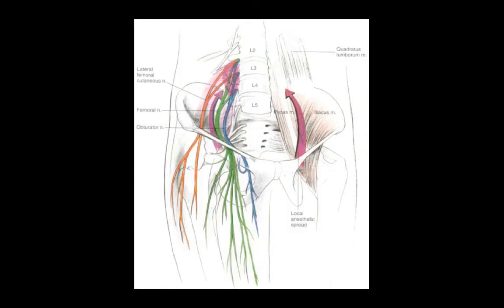But again, just a reminder of anatomy. I mean, essentially, if you get the local to travel far enough posteriorly, it's essentially just an anterior approach to the lumbar plexus. Now, I certainly wouldn't advocate advancing the needle that far. Certainly, when you do get in the right plane and you dissect out the plane, it's a good technique. It's perfectly valid to advance into the space you've created to make sure you get local anaesthetic more proximally. But the point of the big volume of this block is that it should spread proximally without you having to advance the needle too far.